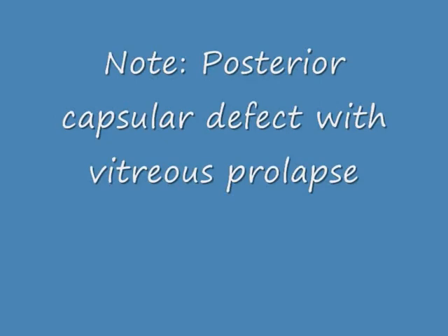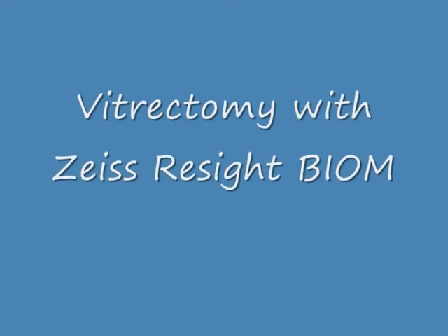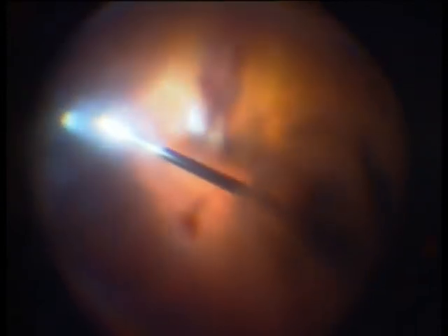You can see now that the posterior capsule is defect and that part of the lens material luxates, so we have to switch over to vitrectomy using a 120 diopter wide field lens. You see opacities inside the vitreous body. The retina is attached, which was known due to the B-scan which we performed once a week until surgery.